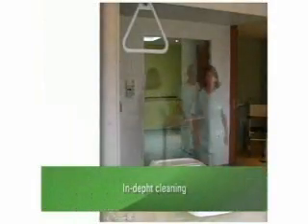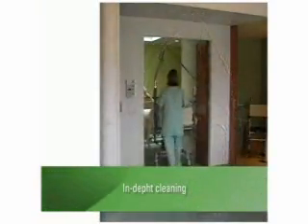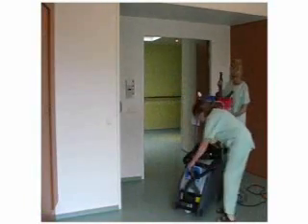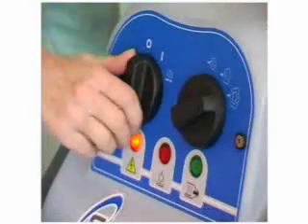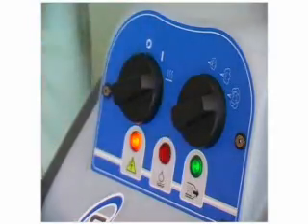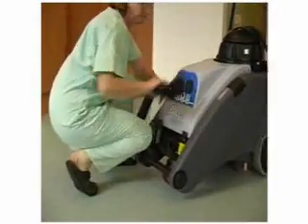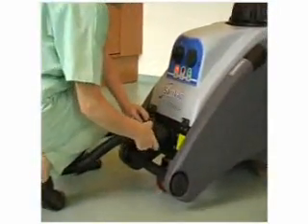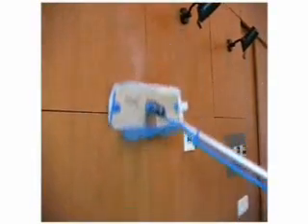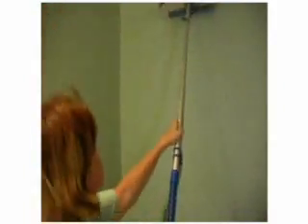After the departure of each patient, an in-depth cleaning of the room is to be carried out. The required elements are a hospital housekeeping cart and its accessories, a steam generator equipped with a steam brush, and a vacuum cleaning system, microfiber wipes for the elevated surfaces and for the floors. The walls are cleaned with the help of a steam brush. The entire wall surface must be steam cleaned.